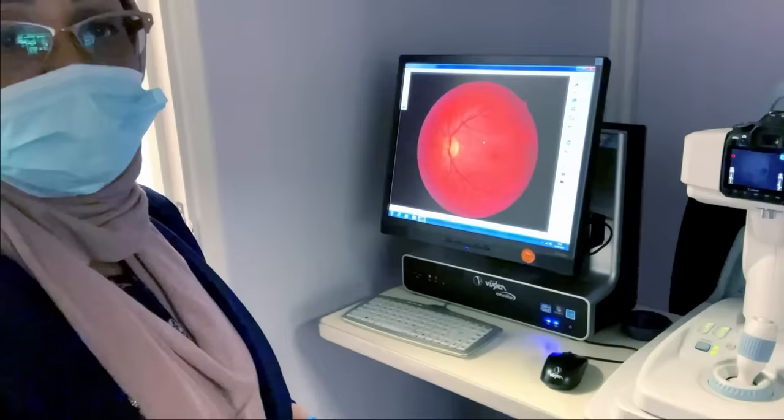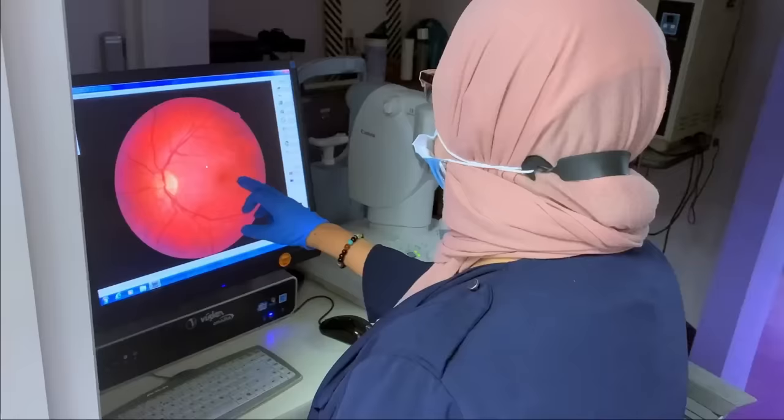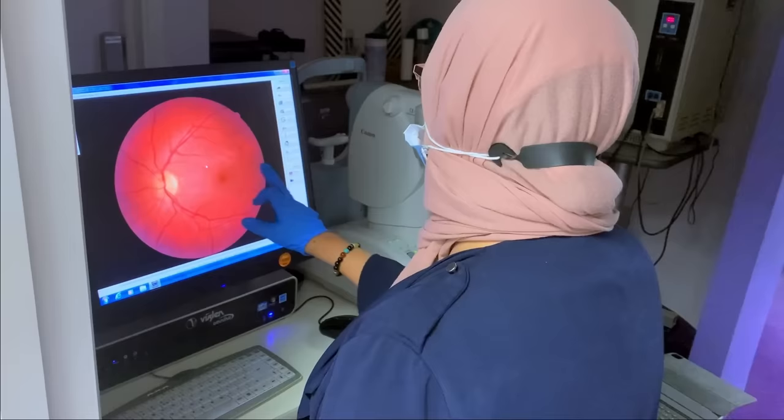And this is called your macula. This is the centre of vision. When you get diseases like macular degeneration, when you're older, in a lot of cases that dark area becomes a very pale grey colour. So in your case, everything is healthy.